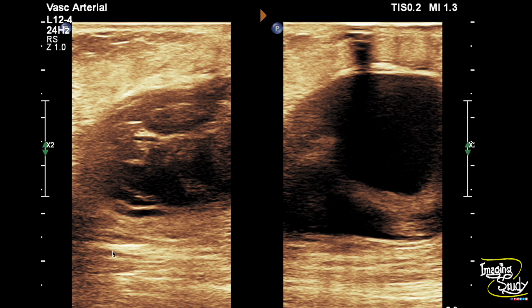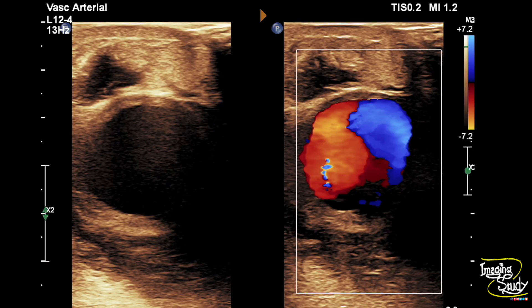On the left you can see an irregular heterogeneously hypoechoic area adjacent to the aneurysm, indicating the perilesional subcutaneous hematoma. Here is another glimpse of the hematoma. On color Doppler, on the right, you can see the pepsi sign or yin-yang pattern.